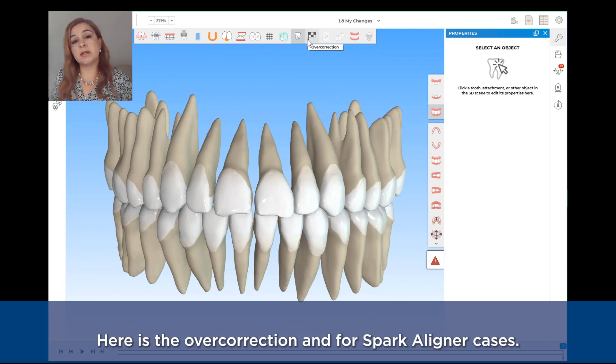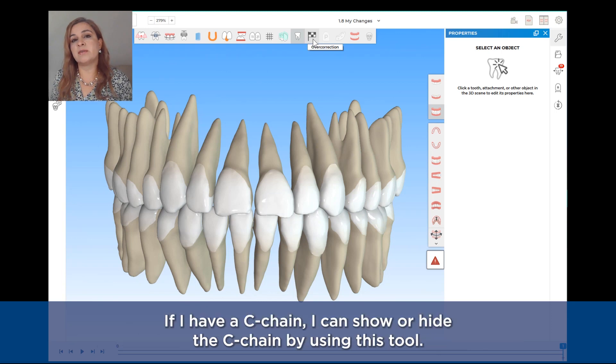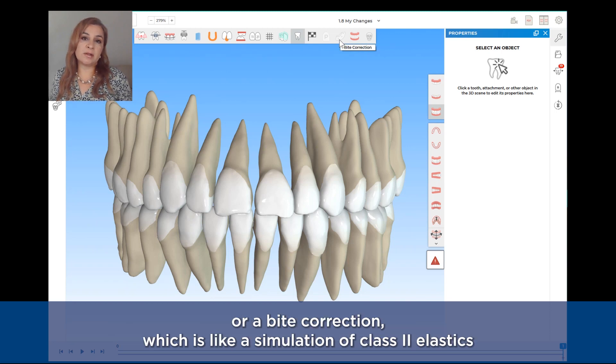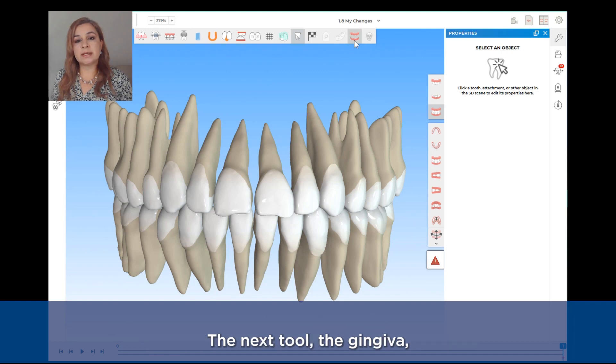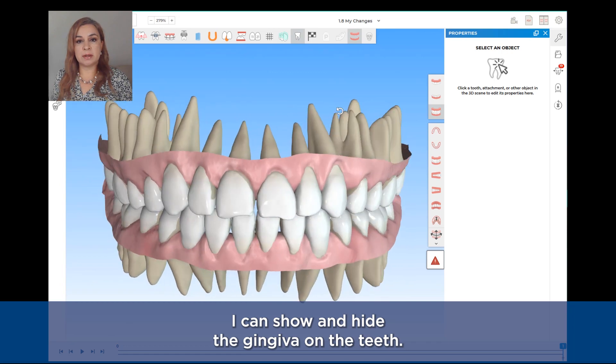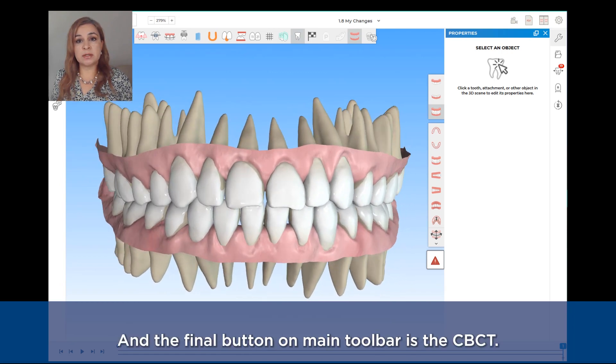With this tool I can show and hide the roots of the teeth. The next tool is the overcorrection. For Spark aligners cases, if I have a C-chain, I can show or hide it using this tool. Similarly, if I have pontics I can show and hide them. Or a bite correction, which is like a simulation of Class II elastics. The next tool is the gingiva — I can show and hide the gingiva on the teeth. The final button in this main toolbar is the CBCT.